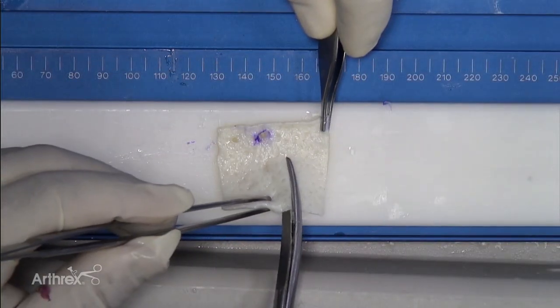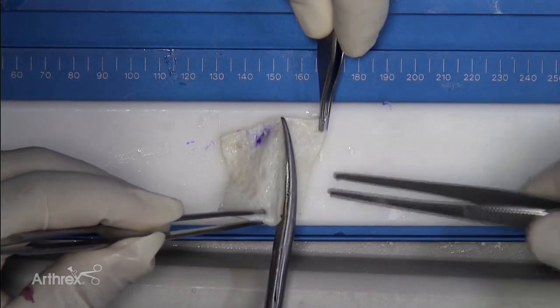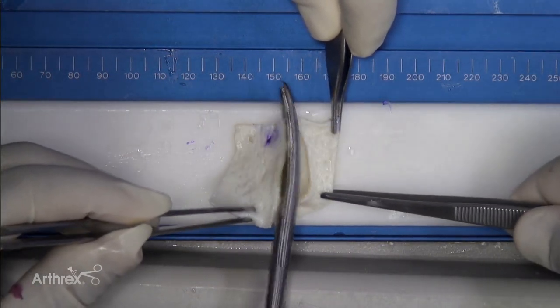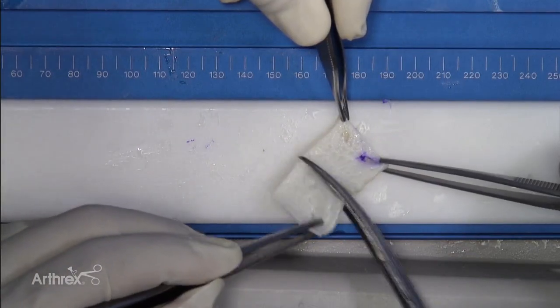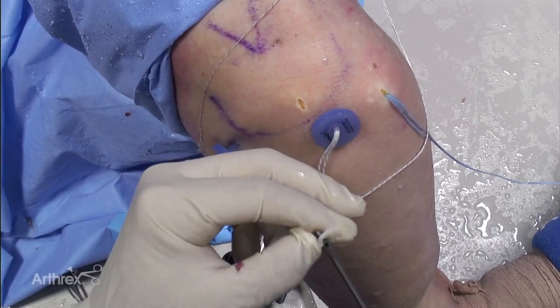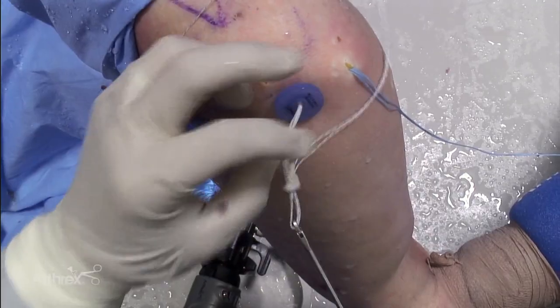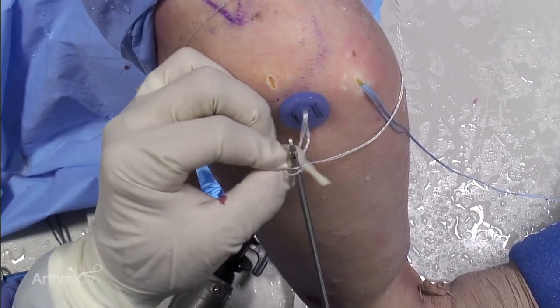The graft is trimmed to size. The posterior medial anchor sutures are passed through the posterior hole in the graft.